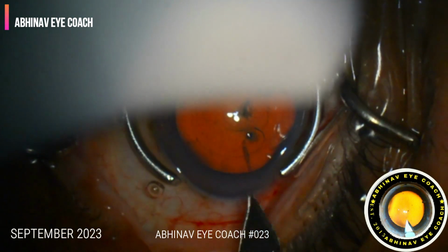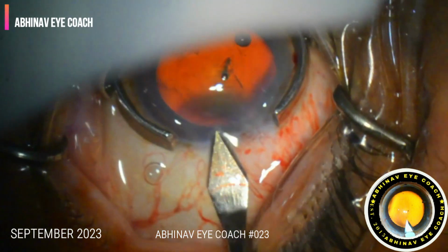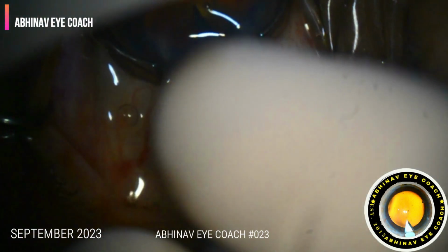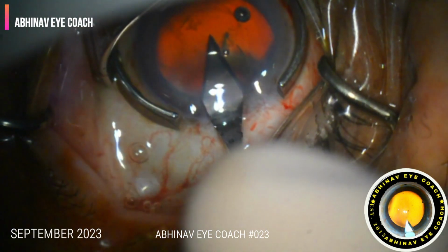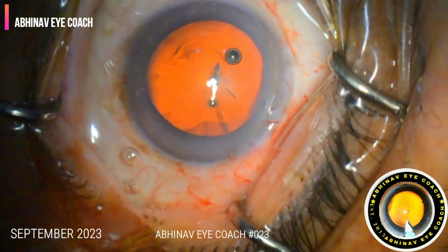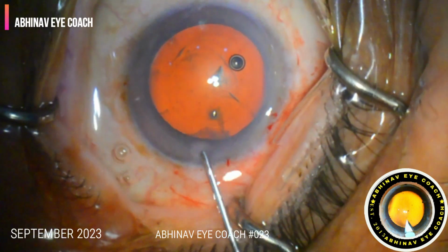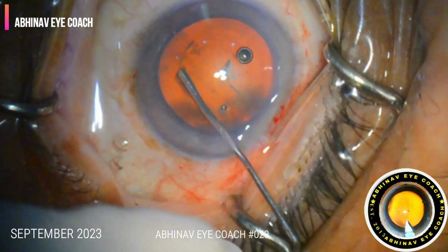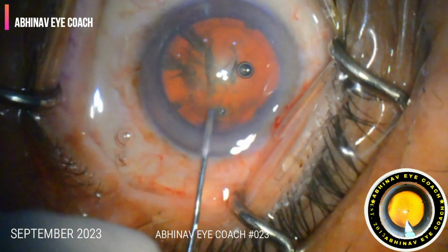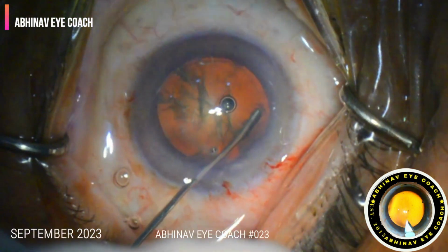The globe is stabilized with the globe stabilizer. The perfect square shaped main port is made with the help of keratome. Hydro dissection is performed. I would like to perform routine phaco emulsification as this is a moderate density cataract. I would prefer the flip and chop technique.